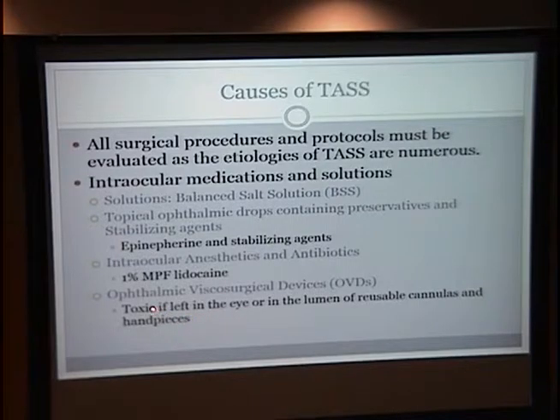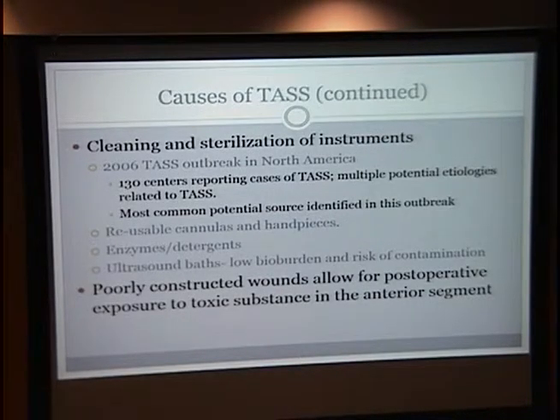Also, I just want to bring your attention to OVDs, ophthalmic viscosurgical devices, which are toxic in and of themselves if they're left in the eyes, but there's also a chance that if the surgical equipment used is not cleaned properly, that they may retain some in the lumen, and upon subsequent surgical procedures, these can be released into the anterior chamber of the eye, causing an inflammatory reaction.